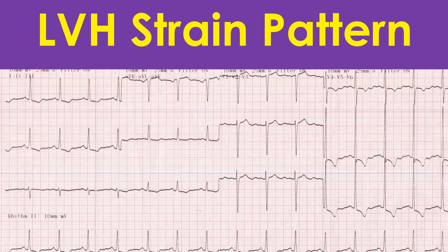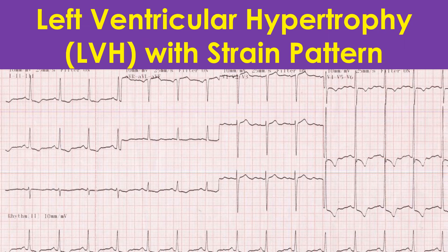ECG showing gross LVH with strain in a case with severe aortic stenosis. The R waves in V5 and V6 are so tall that they are overlapping with the tracing in the channel above. ST segment depression and T wave inversion are seen in inferior and lateral leads.